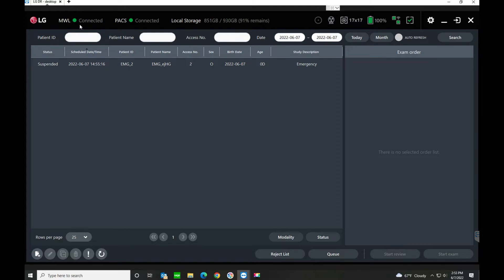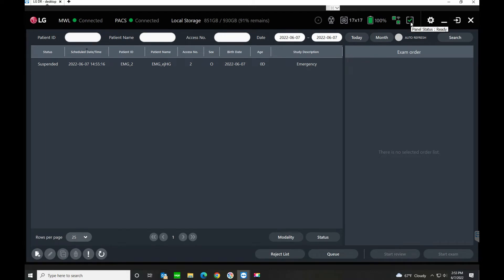Across the top we've got the modality worklist is connected, your PACS is connected, local storage is showing how much hard drive room is remaining. This tells you what type of detector you're connected to. If it were a wireless detector, it would show your battery life and connection status. Everything's good — panel status is ready.